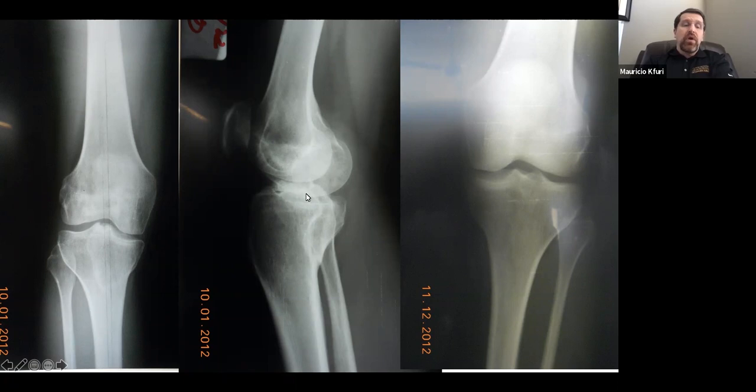If you look more proximally on the AP, it looks like the metaphyseal area is close to what you would expect to see, but there is a very significant tilt of the medial plateau in relationship to the lateral plateau. And you are right, without CT, this kind of assessment is more complicated, but René Marty was one of the individuals that helped me to understand this kind of deformity, because he also described how to address those unicompartmental deformities that are secondary to those kinds of fractures.